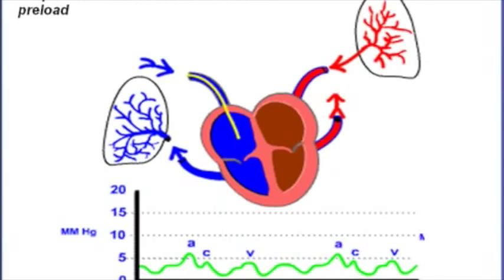So if a patient were to have a Swan-Ganz catheter, which we're not doing here in the ED, you would see the catheter tip, the recording portion of it, be actually in the right atrium. We're doing central line monitoring, and the central line tip is going to be at the opening of the right atrium, so in the superior vena cava. And what those are measures of is the patient's intravascular volume or right ventricular preload.